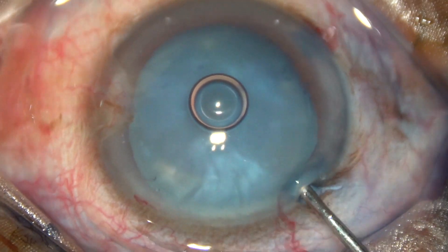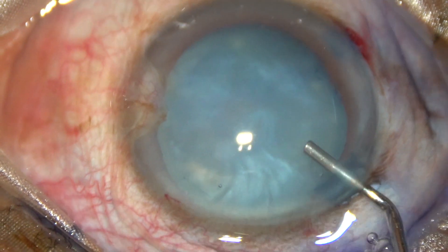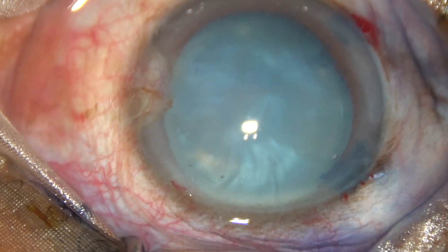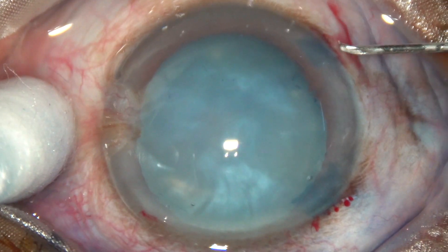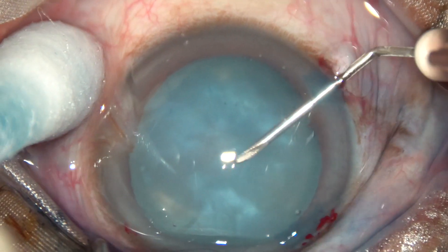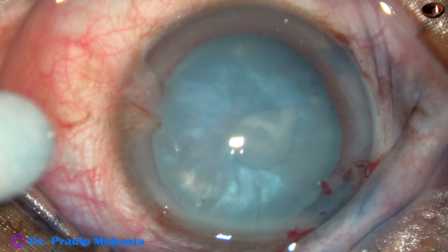After staining the anterior capsule with trypan blue dye, inject 2% hydroxypropyl methyl cellulose and fill the anterior chamber. Now use a 26-gauge bent needle going through the right side port, make a puncture at the center, and create a C-flap.